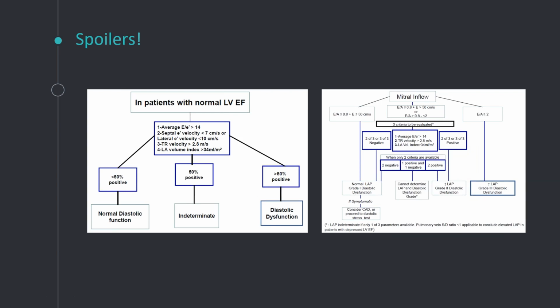But a question came to my mind: a lot of these numbers and parameters sounded very random. And as long as I don't have a great understanding of what's happening underneath, they're just going to be an extra thing to memorize rather than actually fully understanding what's happening. And I found diastology to be one of the less intuitive things in echocardiography, along with regurgitant PISA and vena contracta and flow convergence, those kinds of things. Which sort of prompted me to look a little bit more into it.